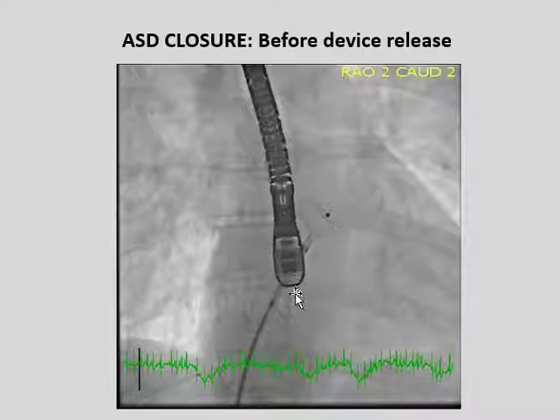is again made of nitinol and is self-expanding. It's deployed across the septum where the hole is, expanded in the left atrial side, and then tugged to ensure it's big enough not to fall through the hole, through the ASD, which has been sized before. And the rest of that sheath is withdrawn, and at the last minute, when they're satisfied that no amount of gentle tugging will release it, it is released and stays in place.